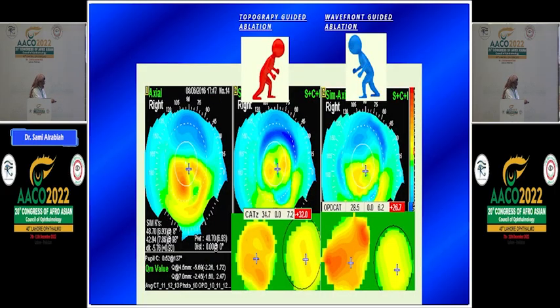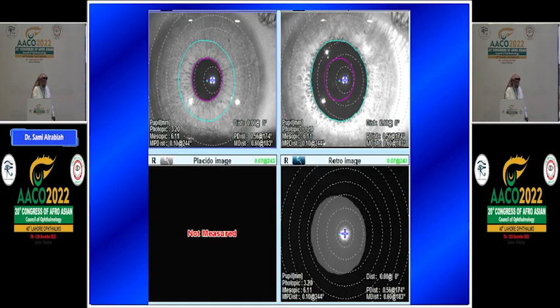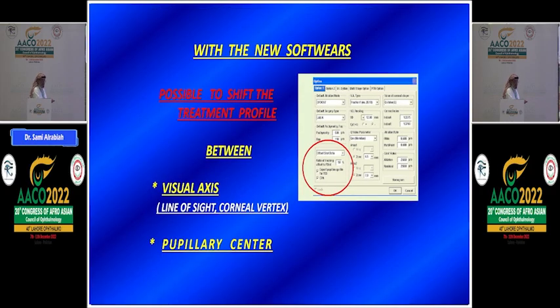Again, this picture is beautiful, and yet it is not good, but look at the function. And this is the angle kappa. You see, sometimes it is so huge that you have to be sure about it. Now, this is really not a major problem.